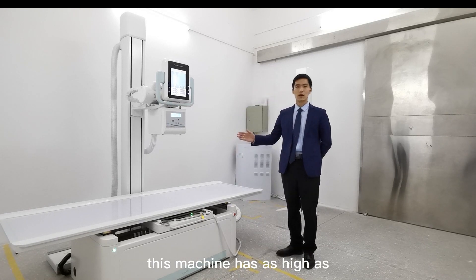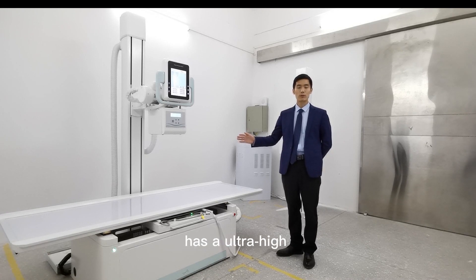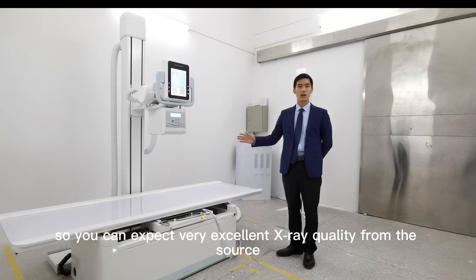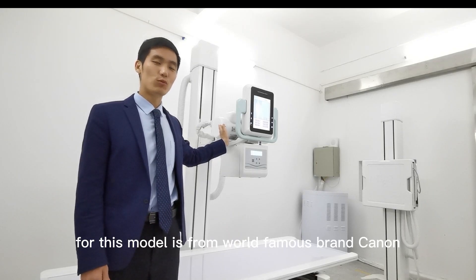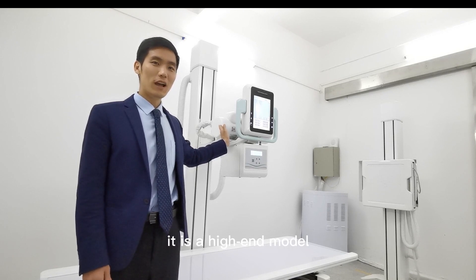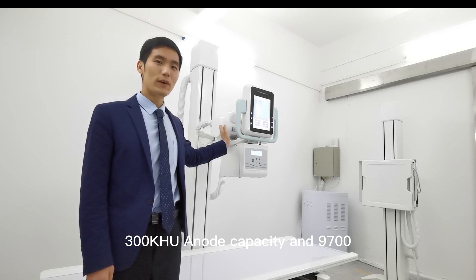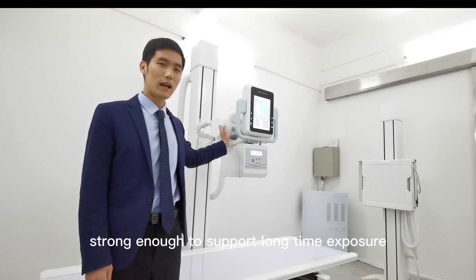This machine has a high voltage of 140 kV and ultra-high frequency of 500 kHz, so you can expect very excellent X-ray quality from the source. The X-ray tube applied for this model is from the world-famous brand Canon. It is the high-end model — 300 kHU heat capacity, 9,700 rotations per minute — strong enough to support long-time exposure.